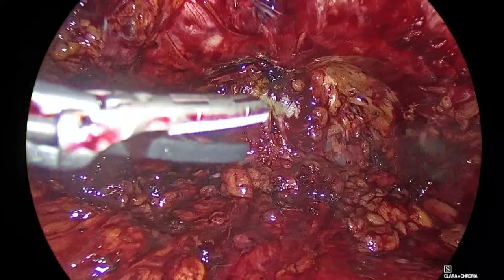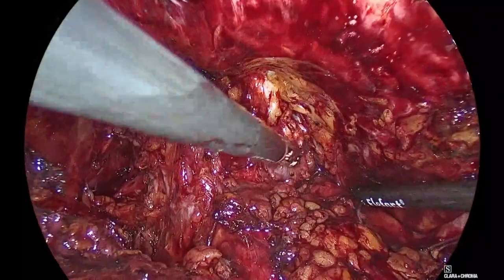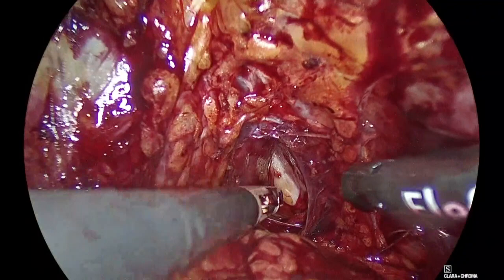So this guy here, good. The prostate is here. I've cleaned the prostate on top from the fat. Right side, Maniote. Leave it with your grasper. Put your grasper here. You see that everything here, our space is limited. So this is endopelvic fascia here. Come in, Padeli. I dissect the endopelvic fascia. I do not cut it. I dissect it.